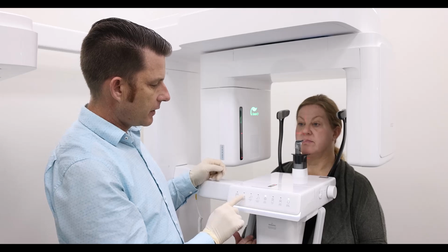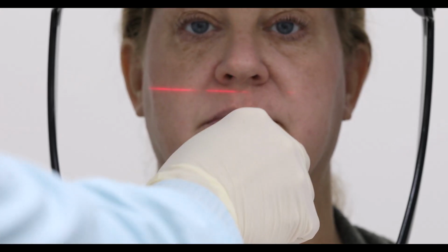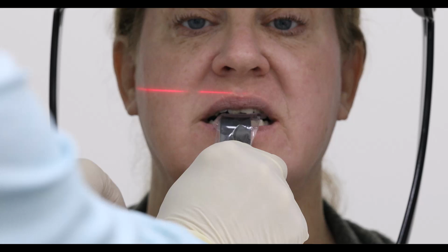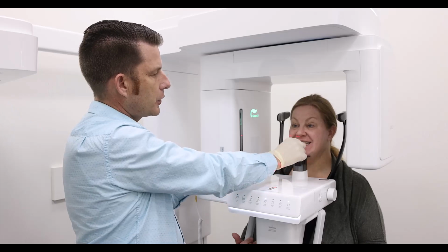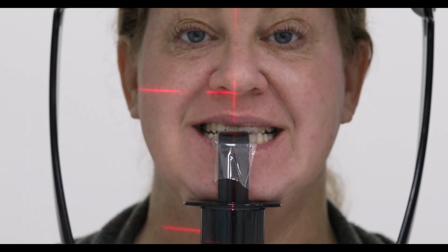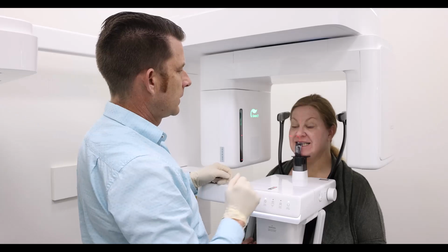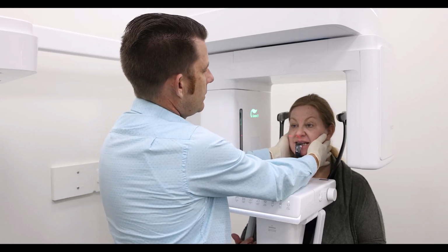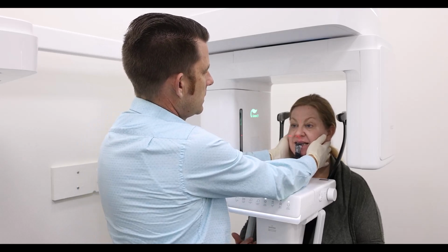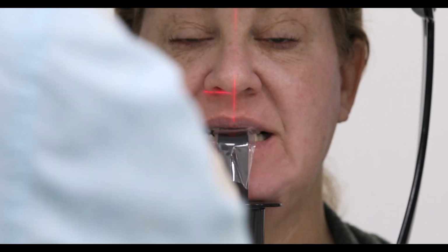In this case, I need to bring the column down a little bit. You go ahead and open and bite on the bite stick. Smile really big. I can see the patient's biting in the bite stick groove. I'm going to push down on the bite stick to ensure the chin is on the chin rest. Next, I'm going to make sure the patient is lined up center. So we're going to go ahead and get you lined up center here. Perfect. Chin's on the chin rest.